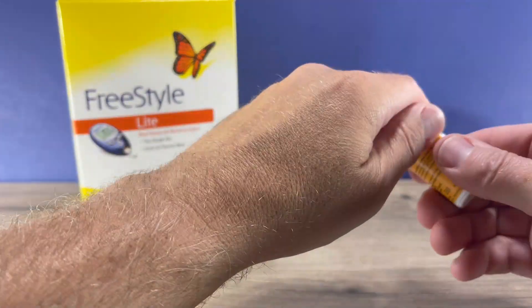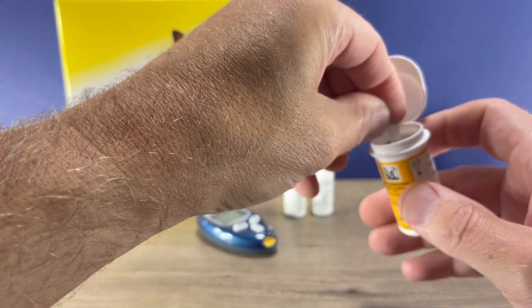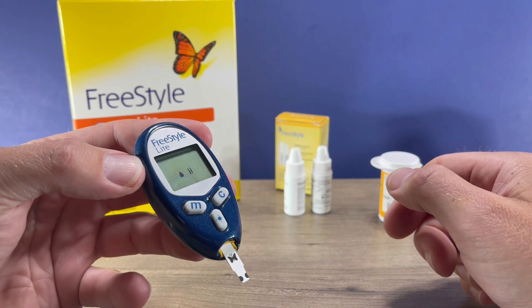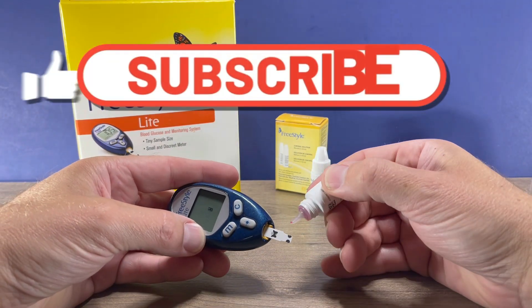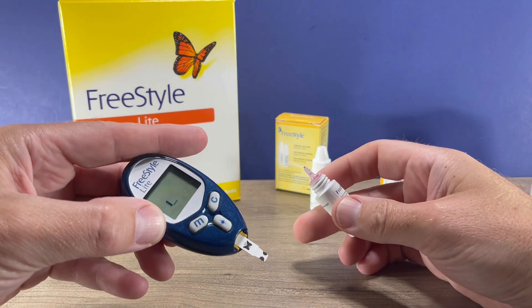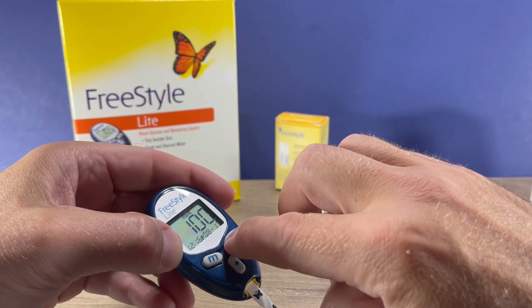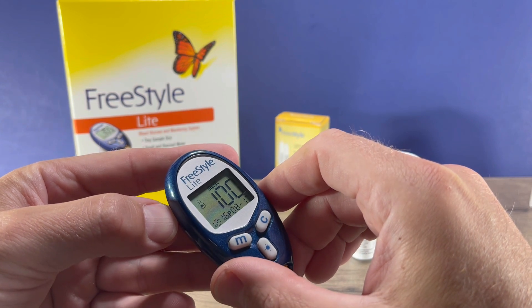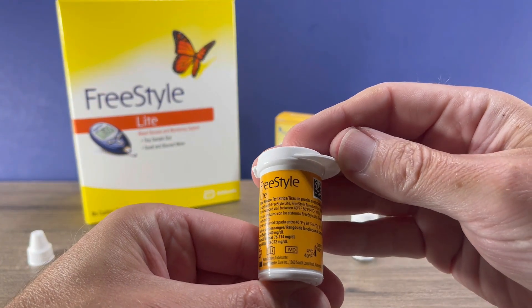To do that, you'll put a test strip into the meter. Wait for it to prompt for a drop of blood, and then you take your control solution and apply it like you would blood until it indicates that the solution has been applied. So that's 100. Press and hold the configure button so the meter knows that this is a control test — there's a little control vial icon that shows up, so it doesn't get included in your history of blood glucose readings. So 100 is of course within that range of 76 to 114 that's printed on our vial of test strips. That tests good.